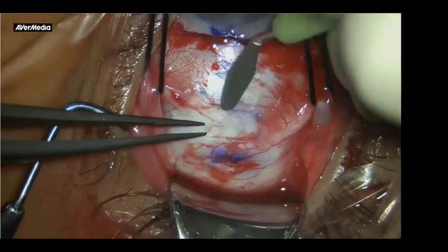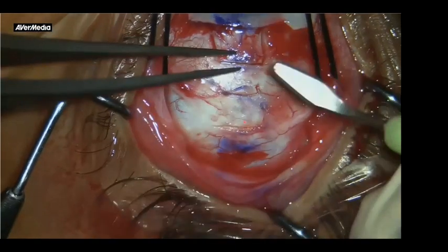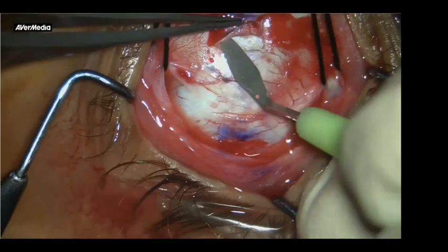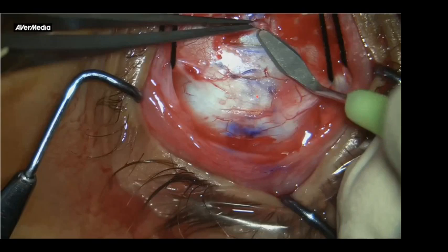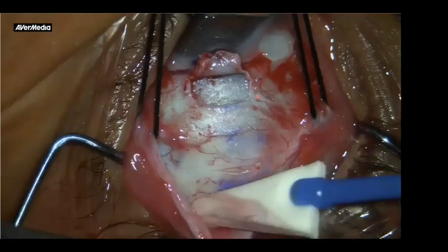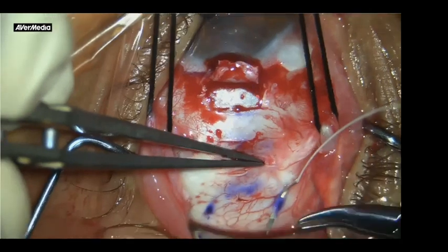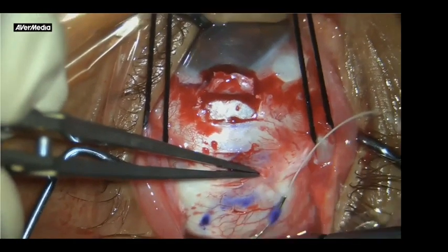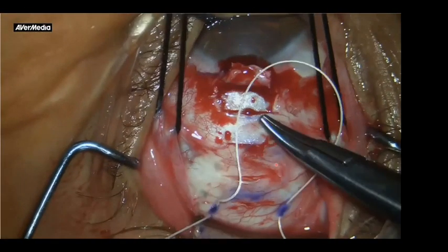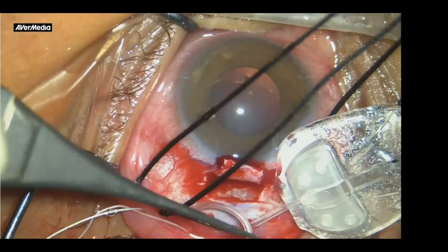And I'm sitting again in the upper temporal quadrant, and then going to the last part, it is a flap or a trapdoor. I know that some of the surgeons are just piercing the limbus and putting graft on this. Again, hundreds of techniques are available, but I dissect the flap, and every now and then I make the field dry, and then I put the non-absorbable sutures. I know there are some schools which are using absorbable sutures, and some which are not using sutures at all. But I'm using non-absorbable sutures because the implant can migrate.